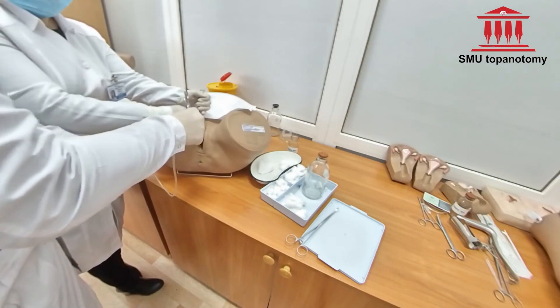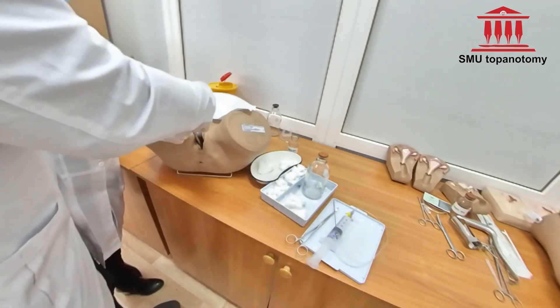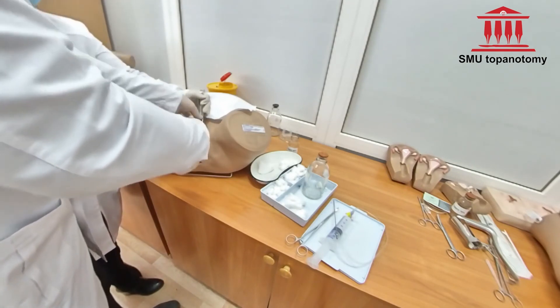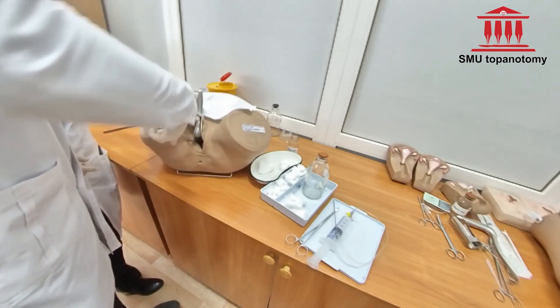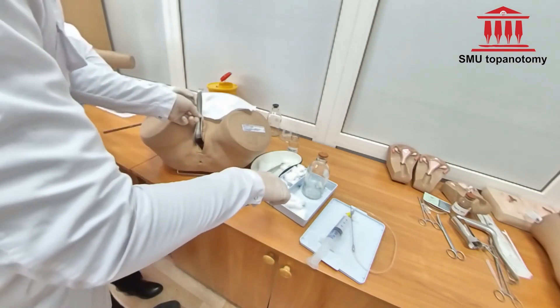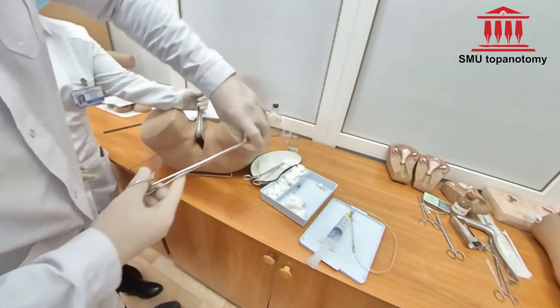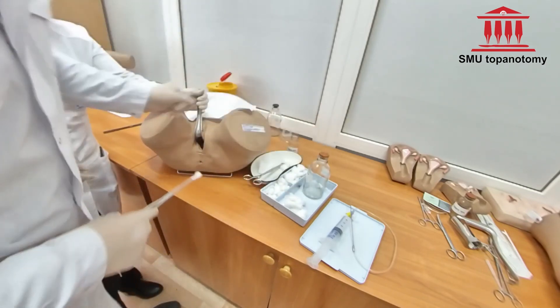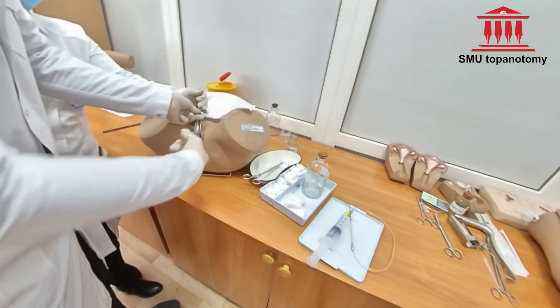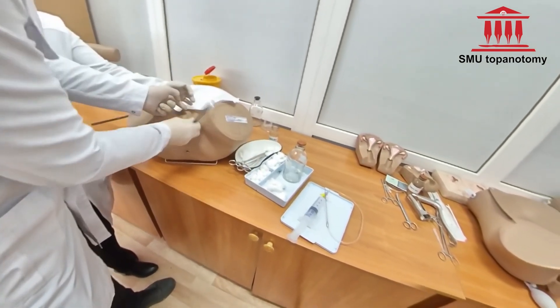Pull the needle out and clean the area with antiseptic solution after the procedure. Send the sample to the laboratory for testing. Thank the patient — this is the end of the procedure.